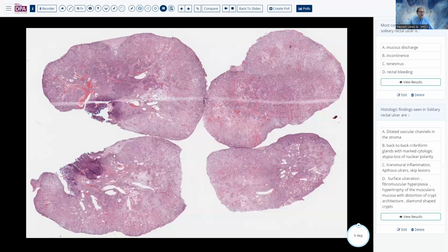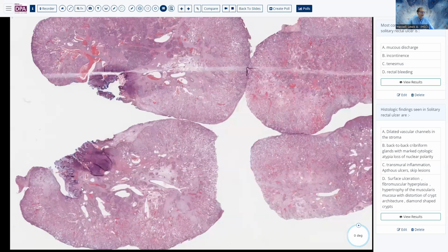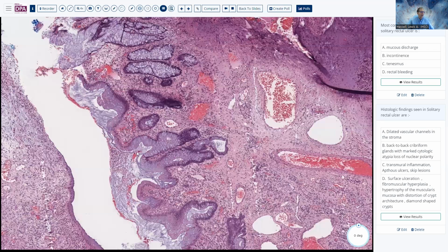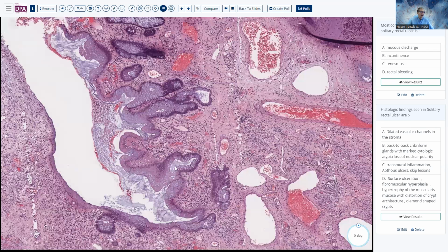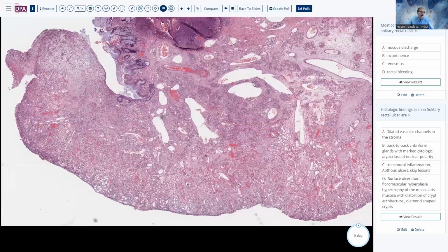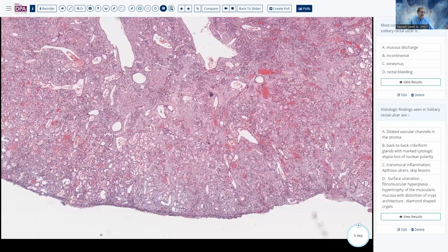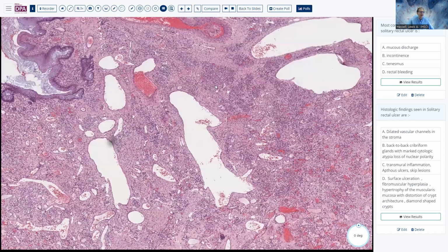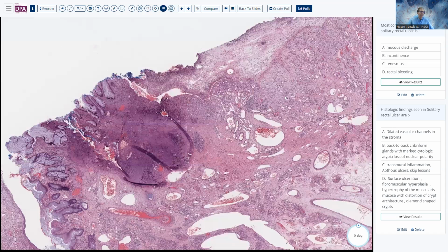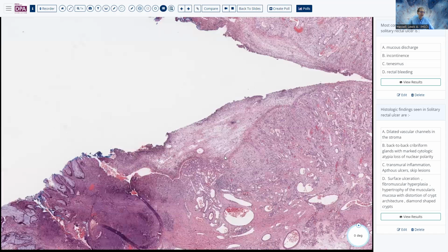So another disorder that can occur in the colon is characterized here. We see these really quite hyperplastic appearing colonic crypts and glands associated with this polypoid granulation tissue that's got wildly dilated vascular spaces, intense capillary proliferation, even to the point of having sort of angiomatous nodules here in a capillary hemangioma type pattern, and then ulcer debris on the surface with ulceration of this granulation tissue.